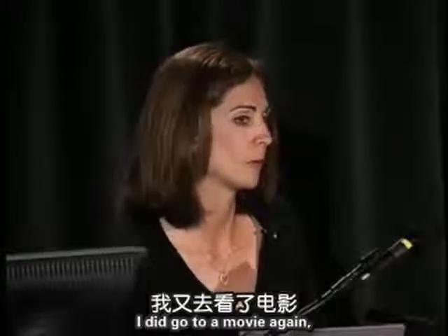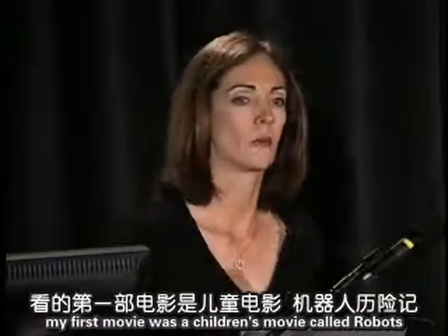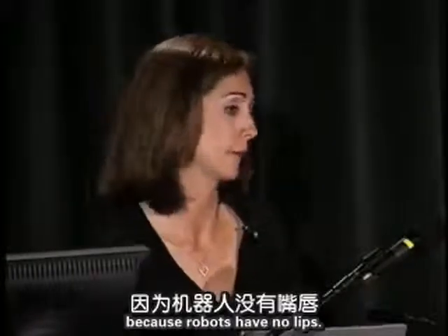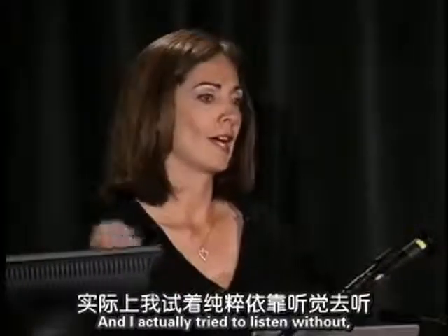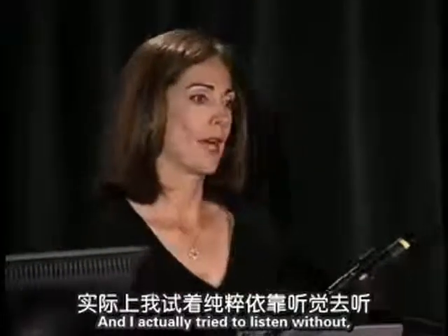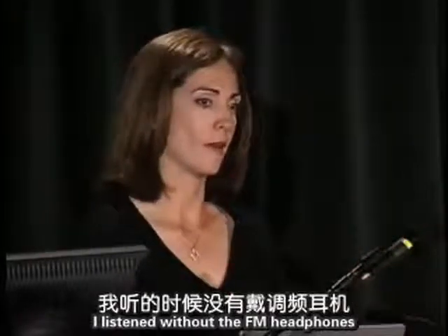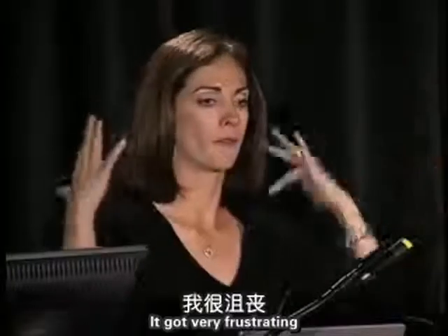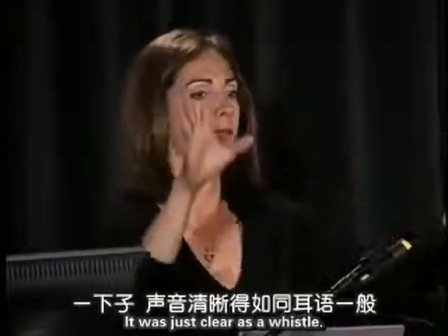I did go to a movie again. My first movie was a children's movie called Robots, which was probably a hard one to start with because robots have no lips. And I actually tried to listen without the FM headphones, this was about at the month mark, and I wasn't able to do it. It got very frustrating. So I put the headphones back on, and boom, it was just clear as a whistle.